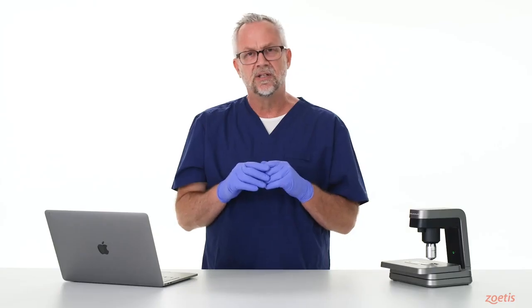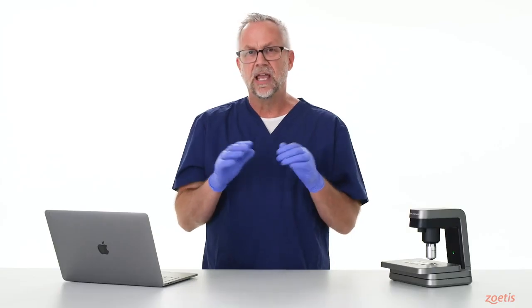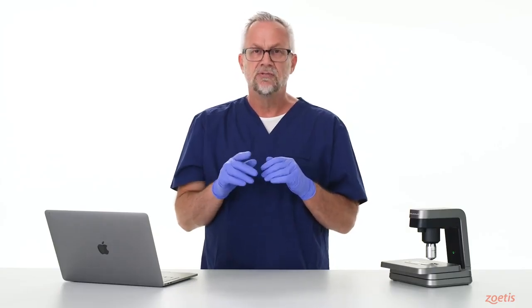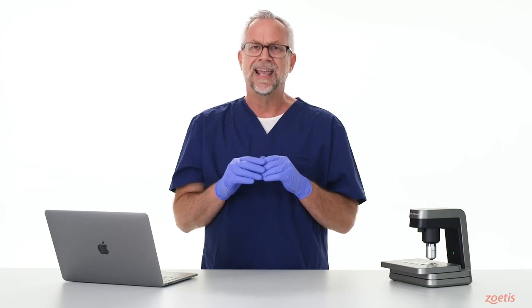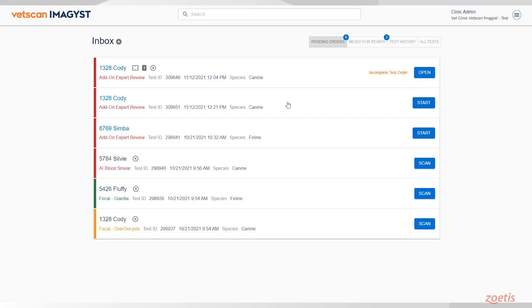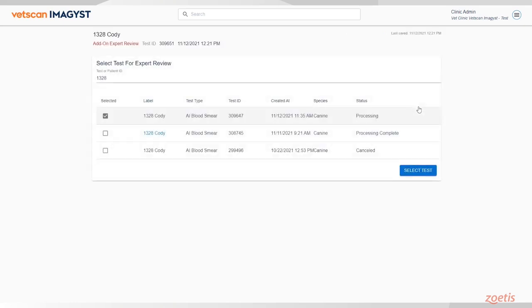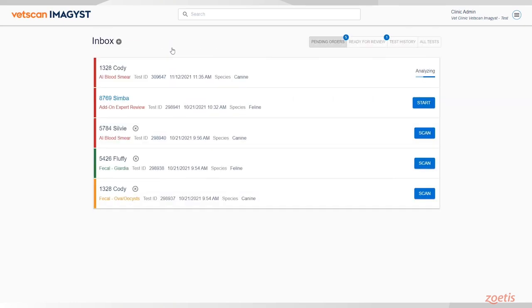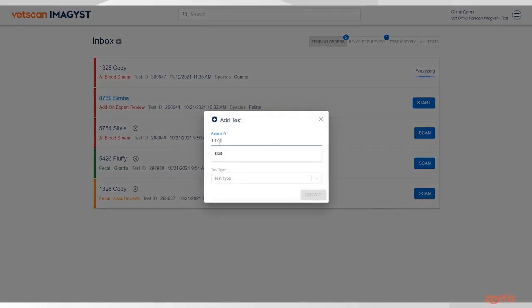If you need a second opinion on any of your AI blood smear tests, you now have the ability to request an add-on expert review. Once the test is created within your Practice Information Management System, go to the VetScan Imagist inbox and select Start for the correct sample. If no integration is available, the test can be created within VetScan Imagist with the Add Test icon.